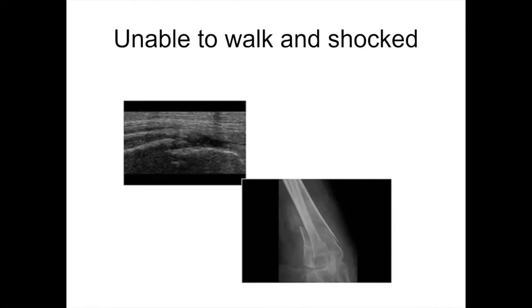This patient was unable to walk and has a fracture at the lower end of the femur. You can see the cortical loss and the step on ultrasound. Patients can become shocked with these because you can bleed into the muscle compartment of the femur. So if a patient comes in traumatised and shocked, it would be a good idea to do an ultrasound of the femur straight away to demonstrate whether there's a fracture — which could be the source of the bleeding.